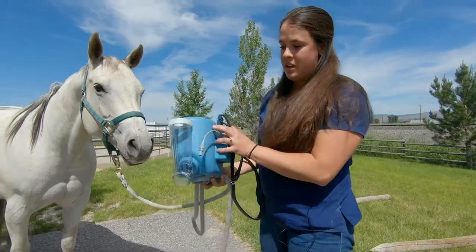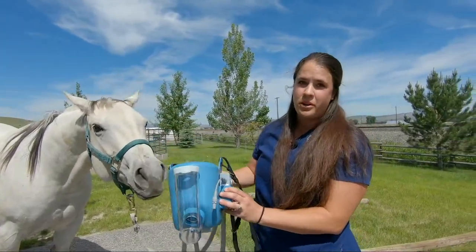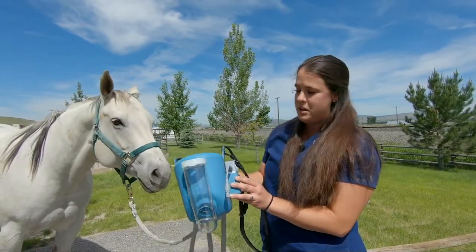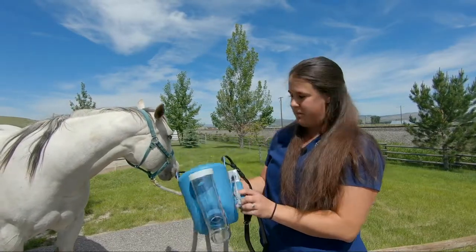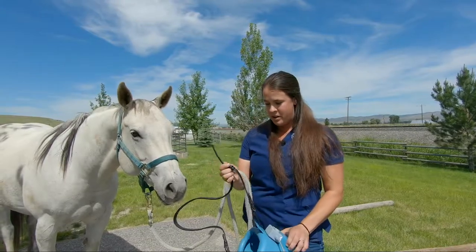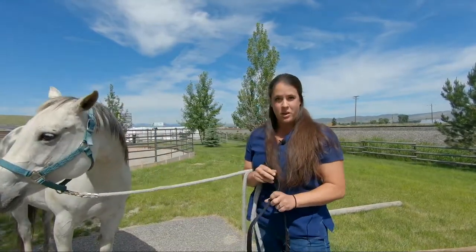So this is the nebulizer. Montana Equine is a distributor of this product, so you can grab these from us if need be, or we do rent them out to clients for treatment. What you end up doing for most horses that have never been around this nebulizer is you kind of show it to them and make sure that they're going to be okay with it.